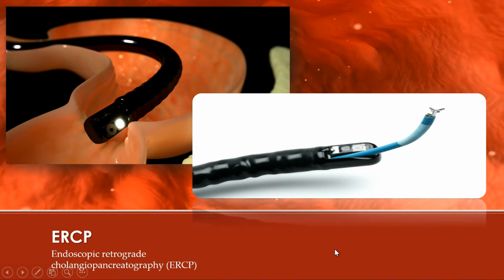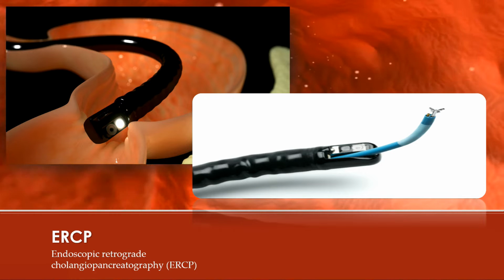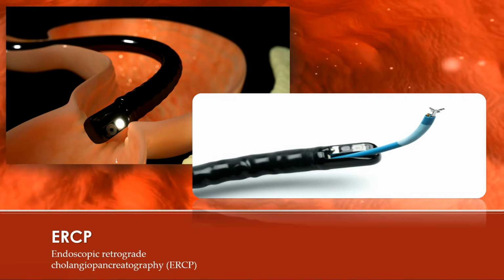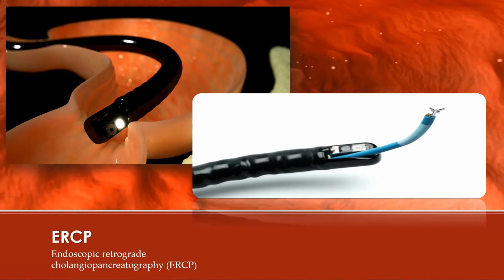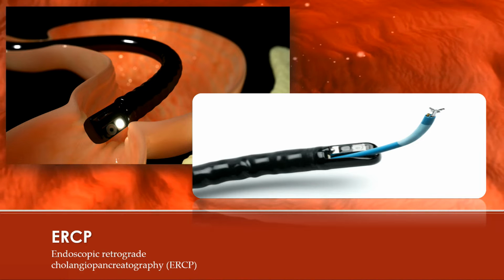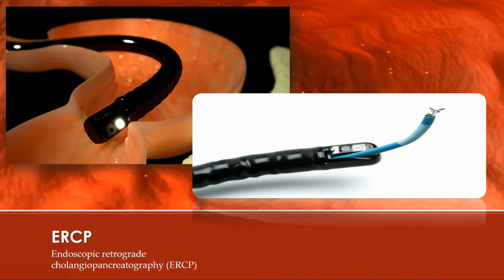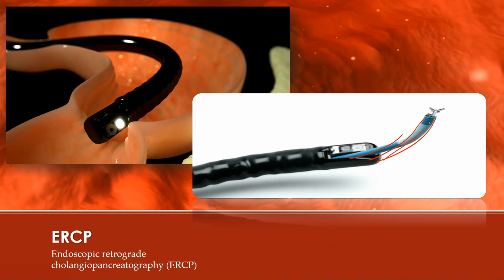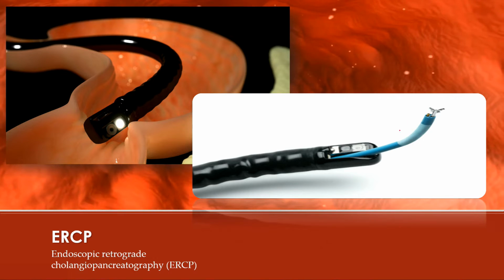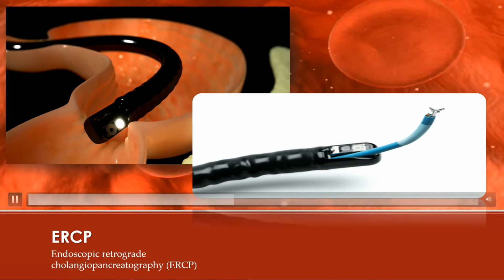Now to overcome these complications, micro ERCP has been invented. What is that? Normal conventional ERCP is a blind procedure. We cannot see anything except the ampulla of Vater. After that, it is radiological guidance. You have to inject a dye, use fluoroscopy, you are seeing on the monitor, you are seeing filling defects, you are seeing the hepatobiliary tree, the dye is going. But now it is possible that inside the ERCP scope, one micro instrument can be introduced that will do the choledocoscopy. It can directly enter into the CBD, and it has its own channel for instrumentation.